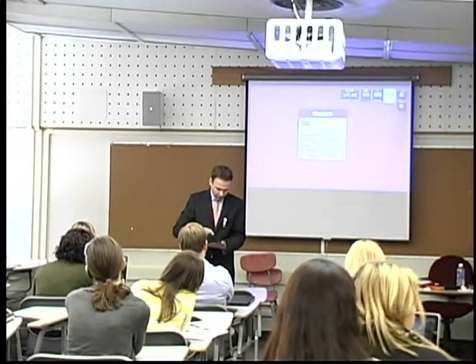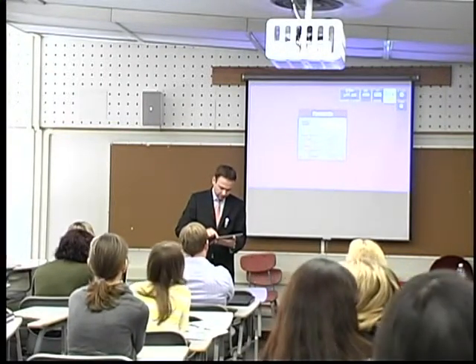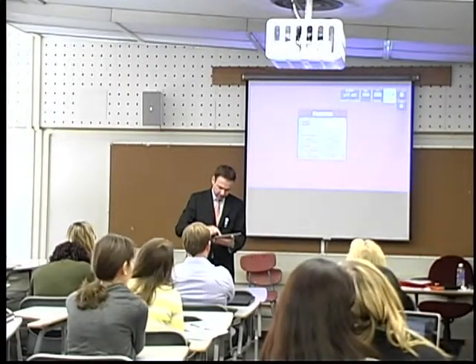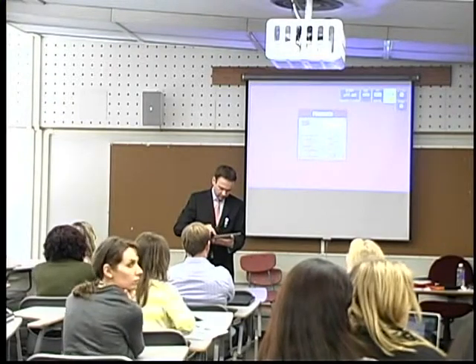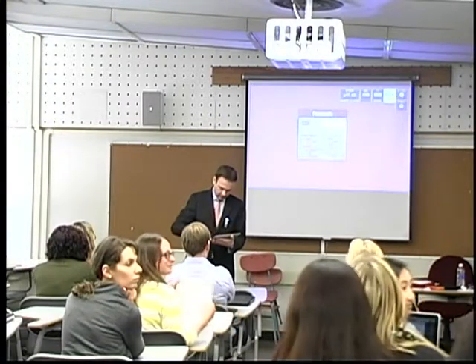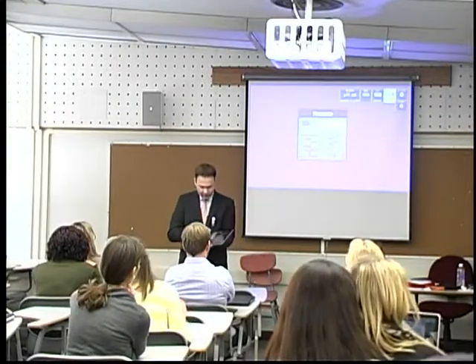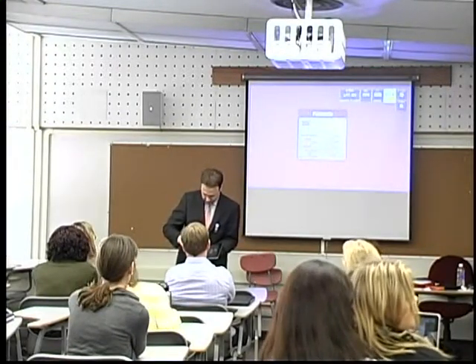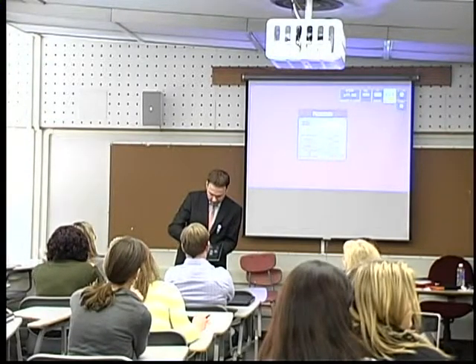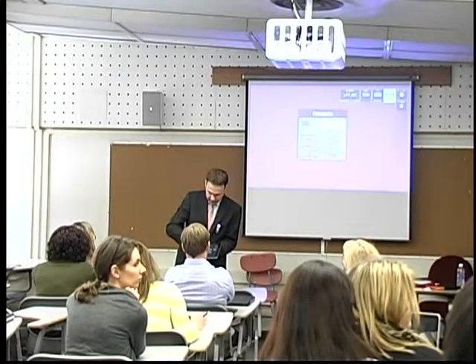I can turn on and turn off those activity sheets if I wanted to start out very, very simple. I go to learner settings, select my learner. For different learners, I can set up different learner profiles, and I can put those activity sheets on and off by putting the X's or the check marks on.